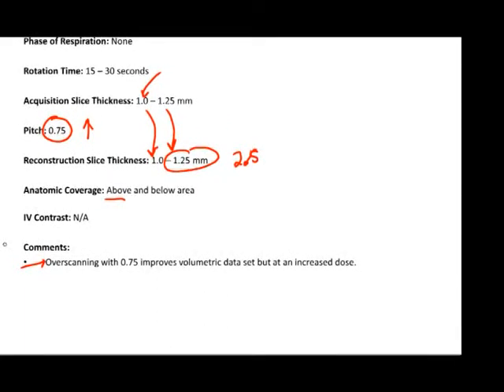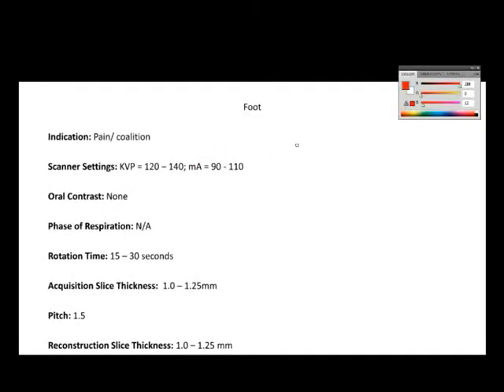So if you have a lower pitch, then you're going to have a higher dosage, but if you have a higher pitch, you're going to have lower dosage but more noise.